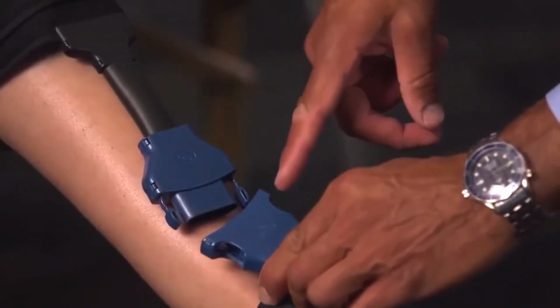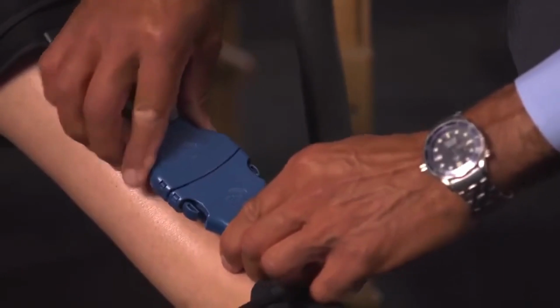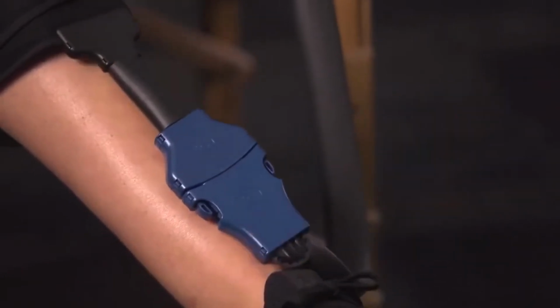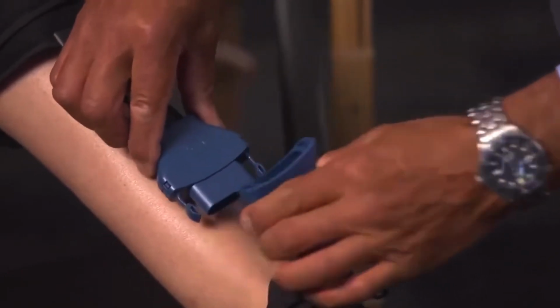To connect the pad to the unit, line up the BREG logos on the tubing and pad connectors and push the connectors together until they click. To disconnect the pad from the unit, press the blue clips and gently pull the connectors apart.